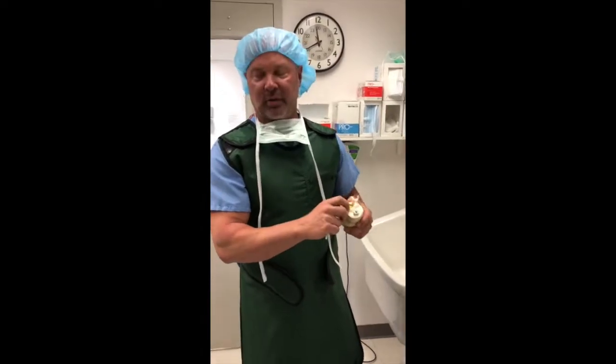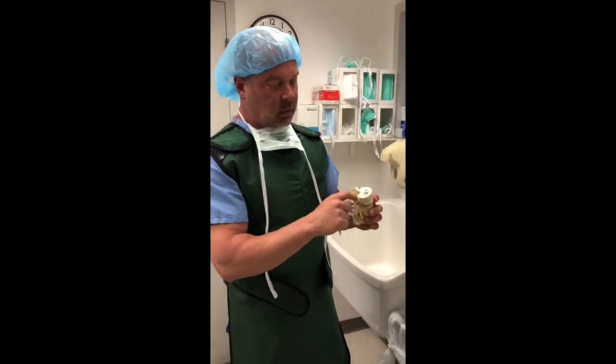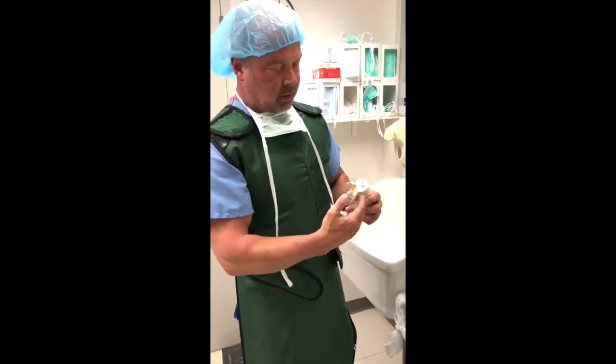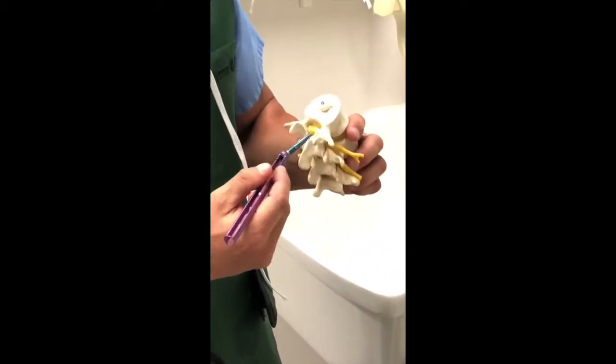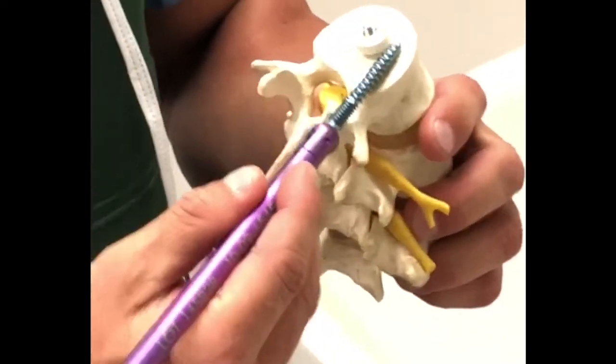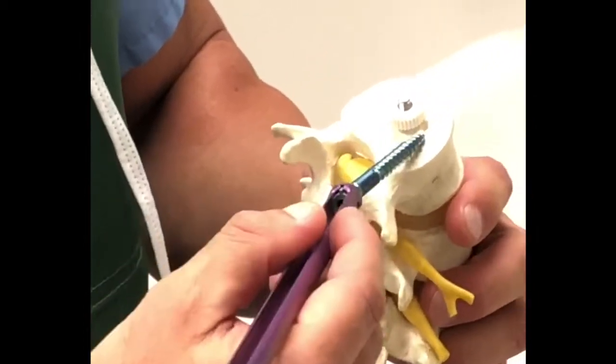Today, the case that we're doing is an interesting case, actually quite common. And so people see this on their MRI and they question what it is. These are pedicles. This is a pedicle screw. So this screw we put in from the back of the spine, it'll go through this bone to the front of the spine and it connects the back to the front.